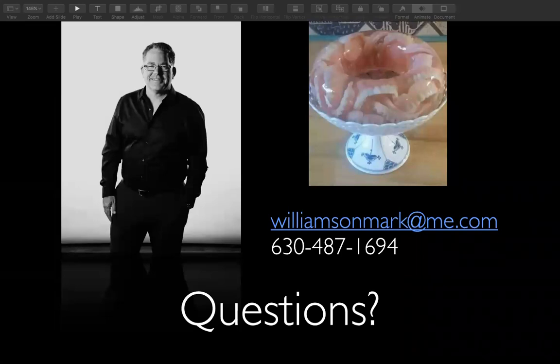You could do a zirconia, but even with zirconia, I think we like to be around 12 millimeters. Having said that, have I done it with a little less because that's what we had to work with? Yes. Has it worked? Yes. Have I done zirconias with 15 or more of space and have they broken? Yes.